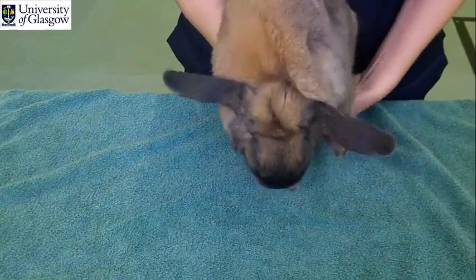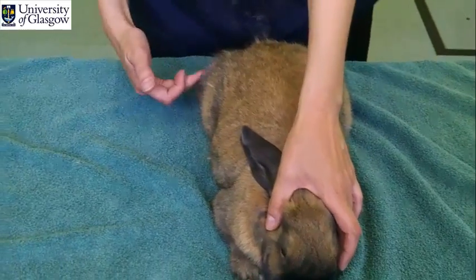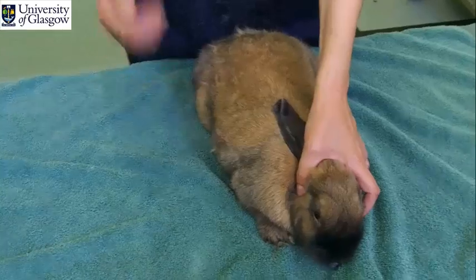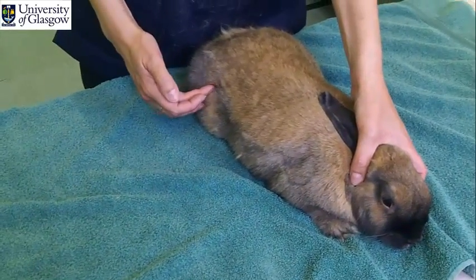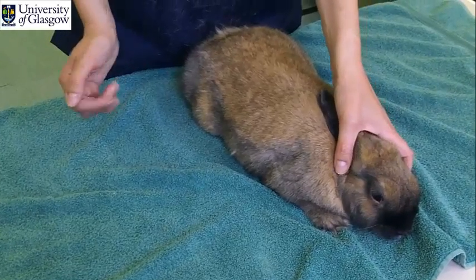We avoid the rest of the leg, the posterior aspect of the leg, just because we have the sciatic nerve that runs along, and we want to avoid touching that nerve.